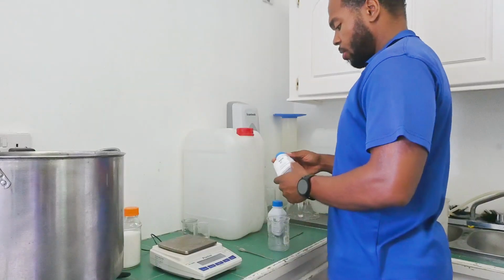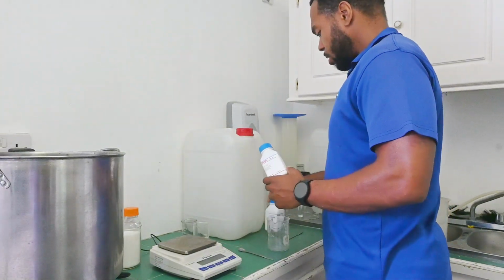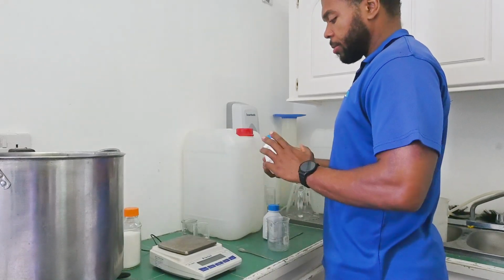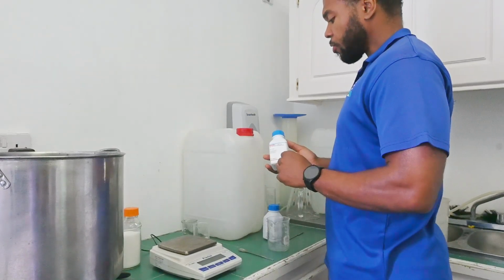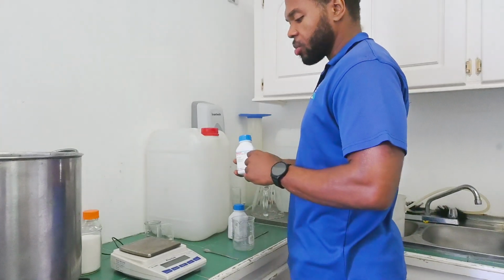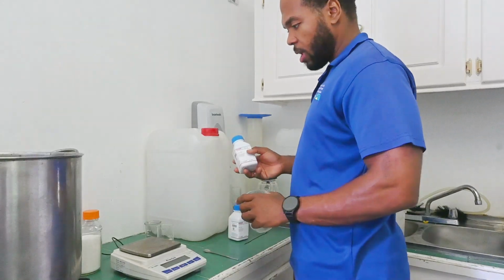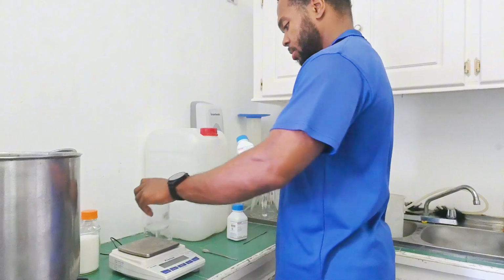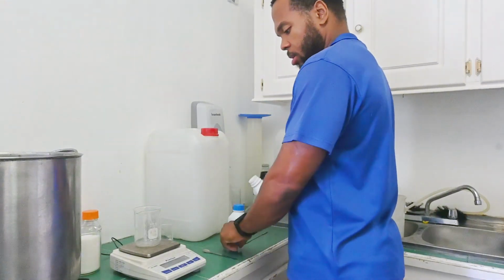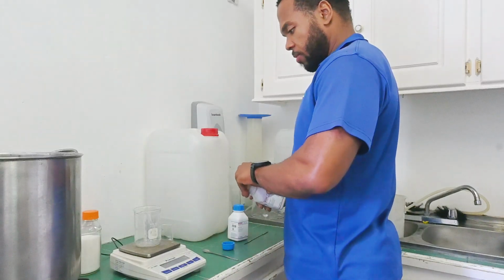Last thing we're going to add now is the gelling agent. It's called agar. It is a powder similar to what gelatin is made from, but that's lab grade, so it has a higher tolerance to heat. So what we're going to do is weigh 7 grams per liter. So we're going to get 112 grams for the 16 liters, and that would be enough to solidify the medium.